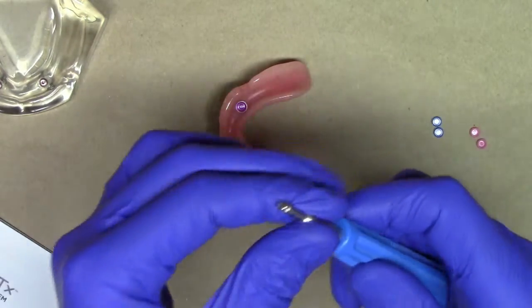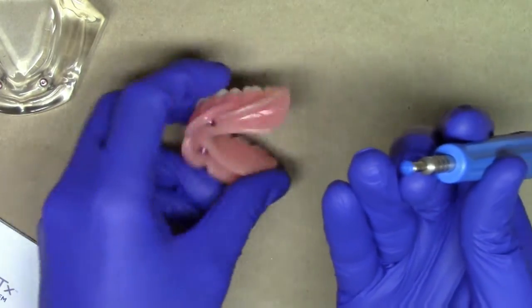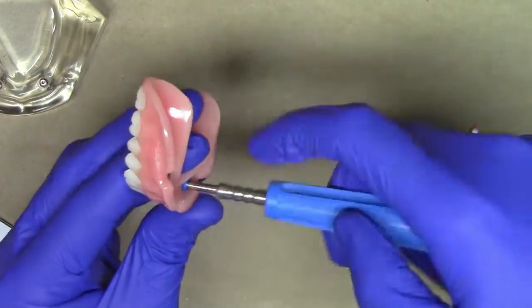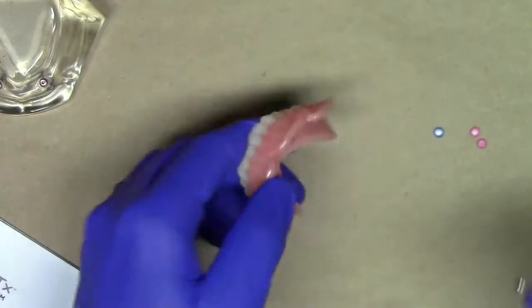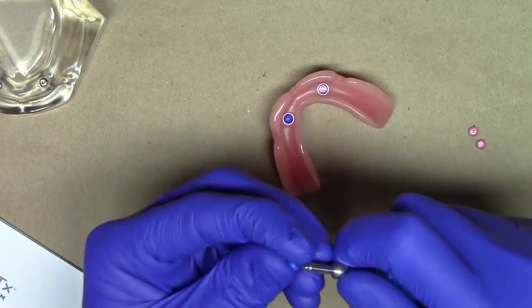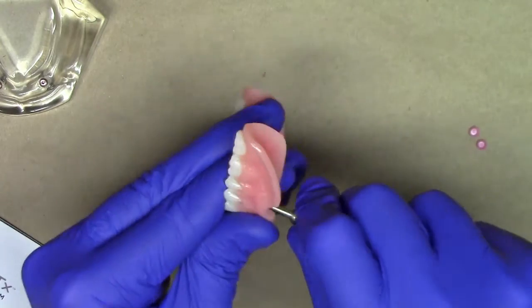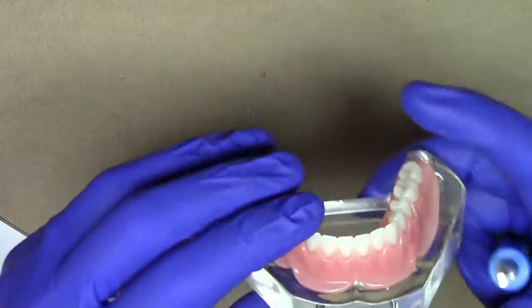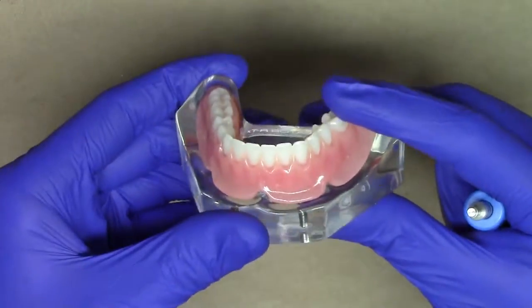Now I'm going to tell my patient, let's go ahead and try our lighter insert and retention. Placing it onto my tool, it goes into the denture — making short work of the light retention. Continuing on with the other blue insert and popping it into place. We're going to try it back on — patient says, 'Oh wow doctor, that's a lot better.'